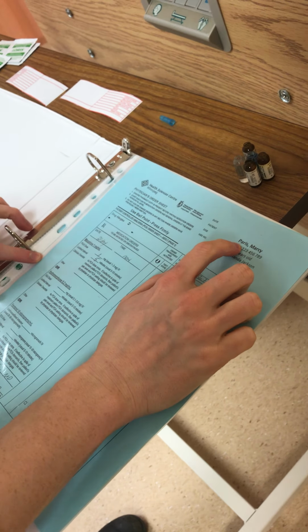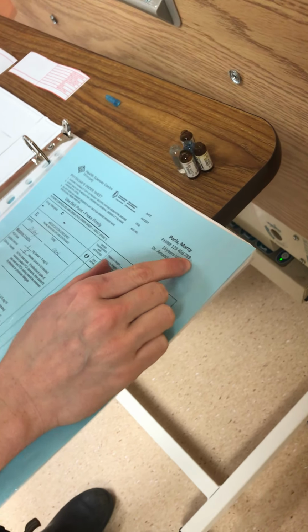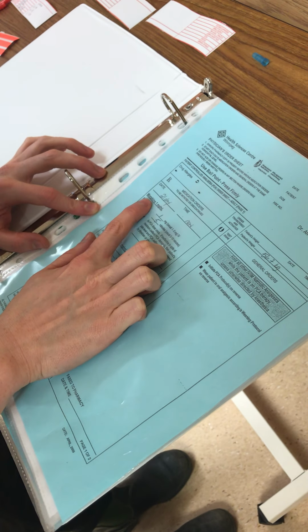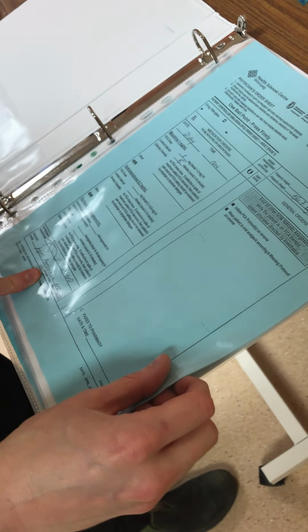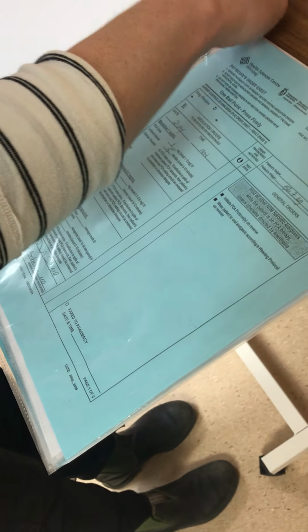We're going to see our patient, Marcy Paris, FIN number 123456789, 55 years old, no known drug allergies. She's been ordered a PCA dose of morphine 1 milligram per milliliter with a lockout interval of 5 minutes. The physician has signed and someone else has signed. So this is good. I can move on to comparing this sheet with the patient MAR.